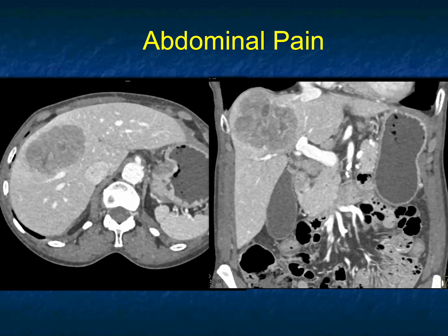Here's a patient with abdominal pain and a six or seven centimeter mass within the liver. The liver shows mild textural change, not the most impressive for cirrhosis. There's some thickening in the GE junction — could that be adenopathy? I couldn't really exclude a tumor. This lesion does not look like focal nodular hyperplasia, and it does not look like a hepatic adenoma.